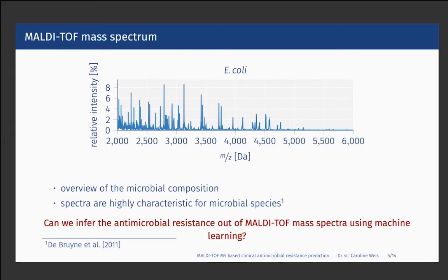Our research into MALDI-TOF mass spectra is motivated by one single question. Using machine learning, can we extract more information out of the spectra than just the species? And the phenotype that we are specifically interested in is antimicrobial resistance.